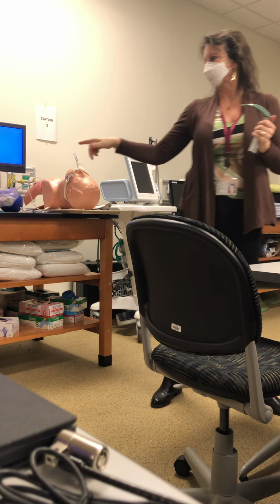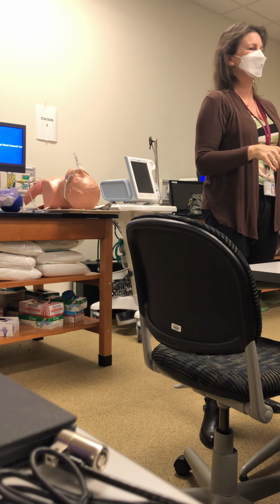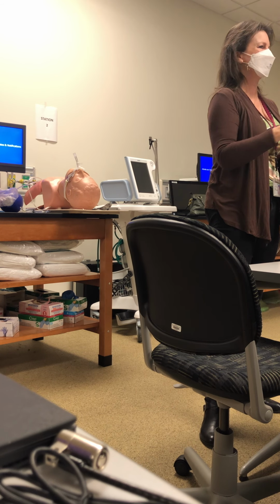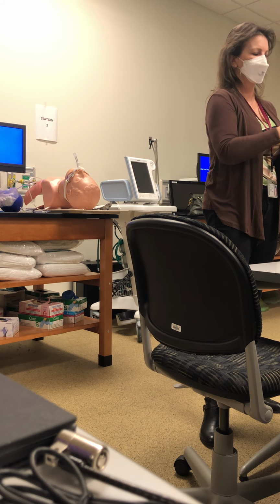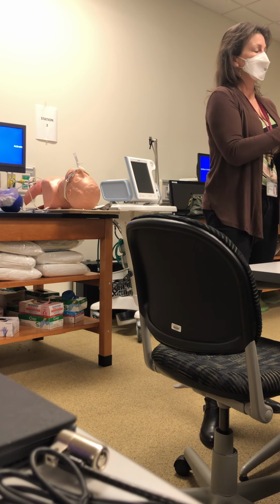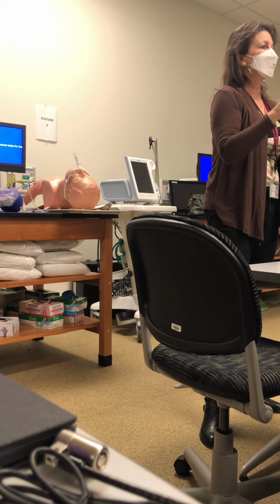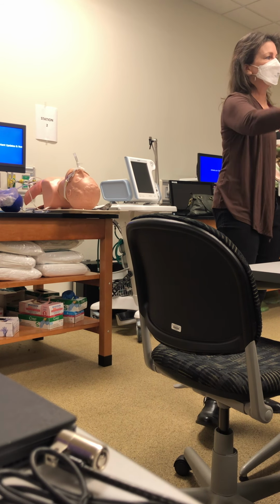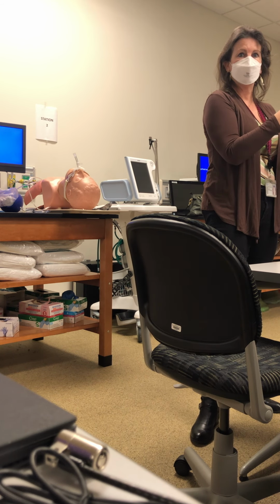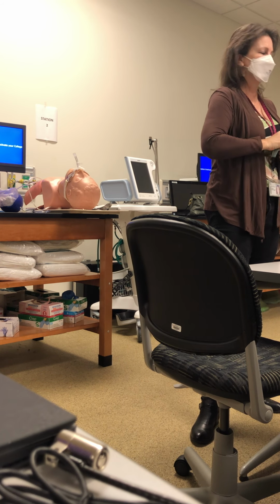But the metal blades, you can screw the light in. Like if you turn it on and the light does not come on, okay? Couple things to troubleshoot that is by twisting the light bulb, trying to reset this to make sure it's seated right, and also to try to replace the batteries in here, okay? So that's why when you go on your shift, you have to do a check of your code card to make sure your handle works, your lights are working, because you don't want the light not to work in an emergency. All right, that's not the time.